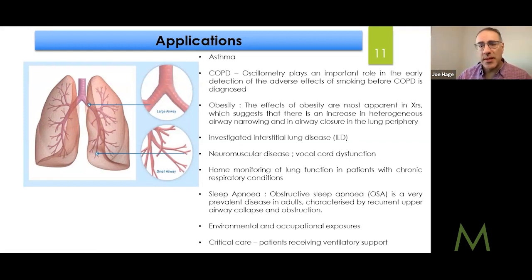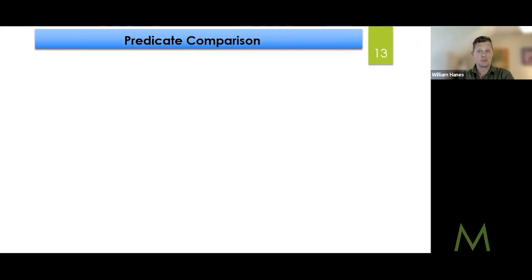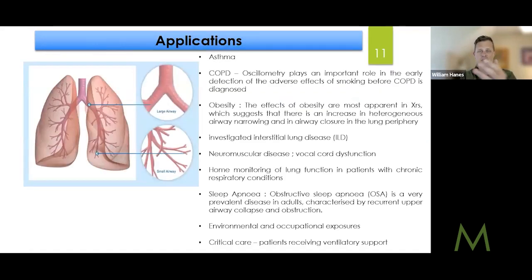He also considered an FDA submission strategy, so he is thinking about the US. Well, right, and so here you need to think about how this fits into the physician workflow and how they're going to get reimbursed for these things. And the more steps you add, and the more costs you add, if they're not getting paid for anything, they're not getting any more data, any better ways to make patient diagnoses, it's going to get killed very quickly. And so you need to look at how they're normally diagnosing things like obstructions right now, and whether they're just doing bronchoscopies and things like that, where they're getting reimbursed for those already. So if you end up taking away some of these procedures, again, the physicians might push back against something like this.